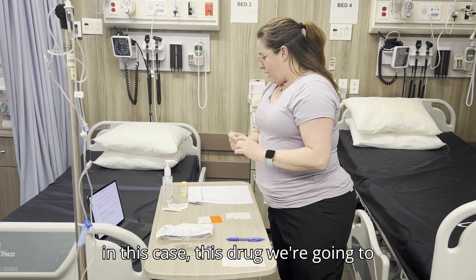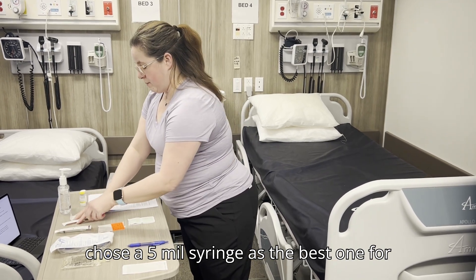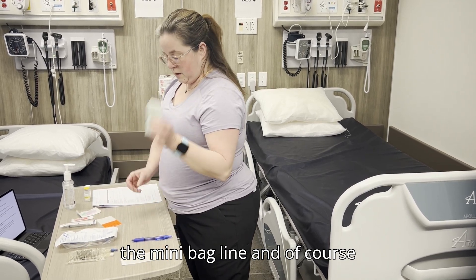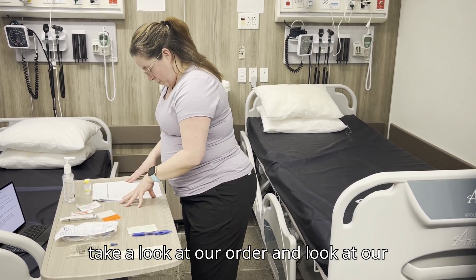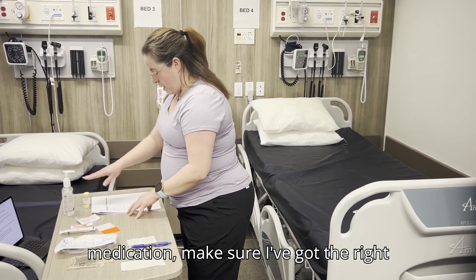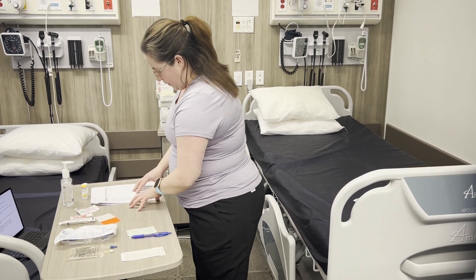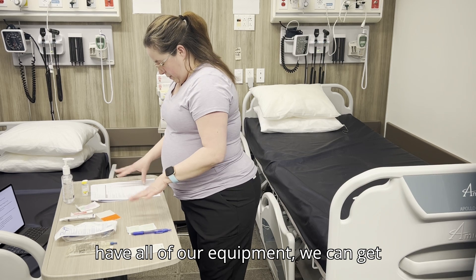We're going to reconstitute this drug with 4 mils, so we chose a 5 mil syringe as the best option. We also have our blunt fill mixing needle. Don't forget a medication label for the mini bag, and of course your alcohol swabs. Next, we review the order, check the patient's allergy history, confirm the right medication and diluent — normal saline — and read the label. In many institutions you would also scan the medication as an additional check.